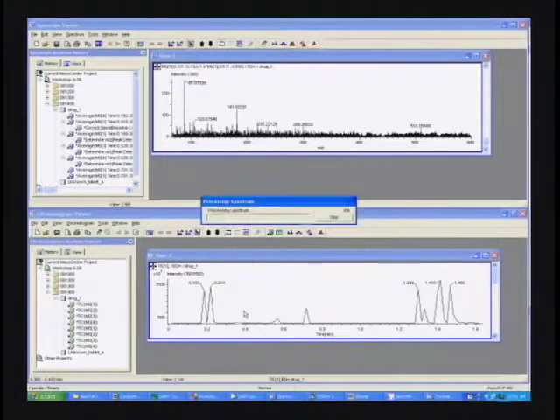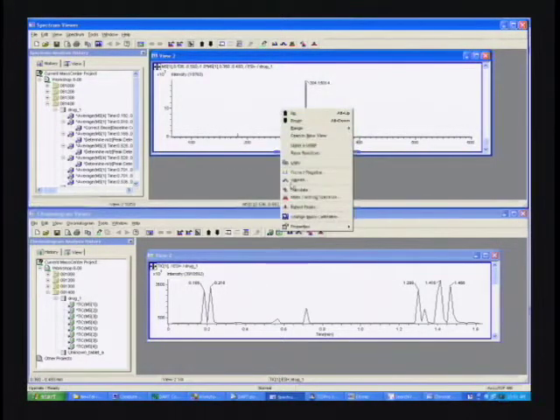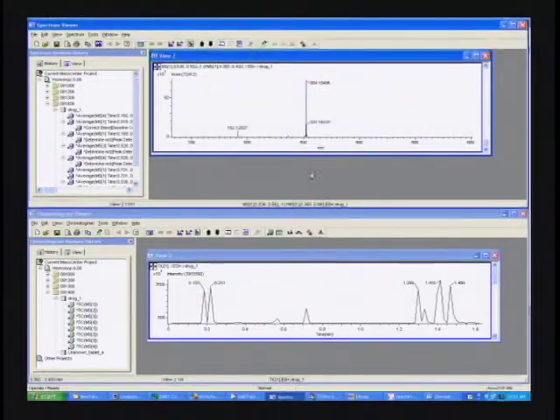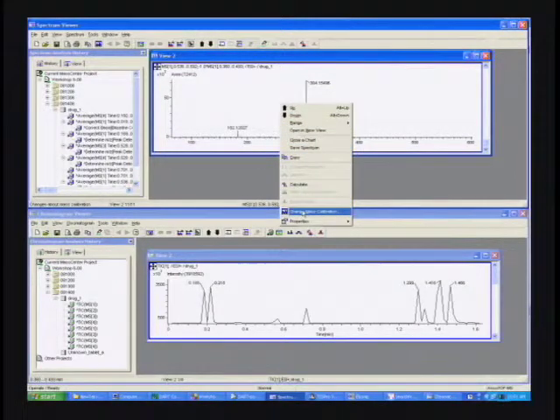Get a good spectrum up here of the cocaine peak. There we go. Alright, so now we need to centroid this data, and that will give us our histogram spectrum. And what we're looking for is the cocaine peak to be at 304.1549, which it is in fact pretty darn close at the moment.